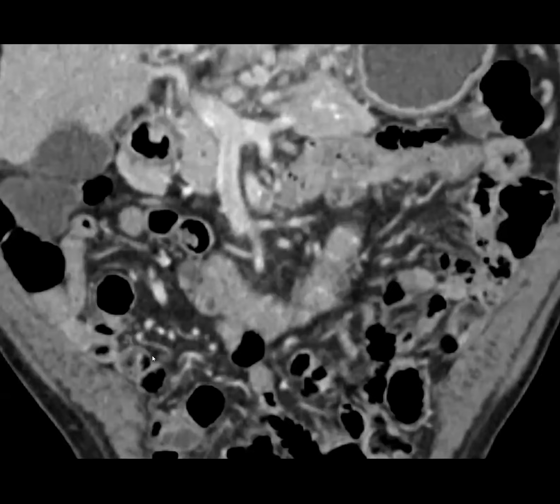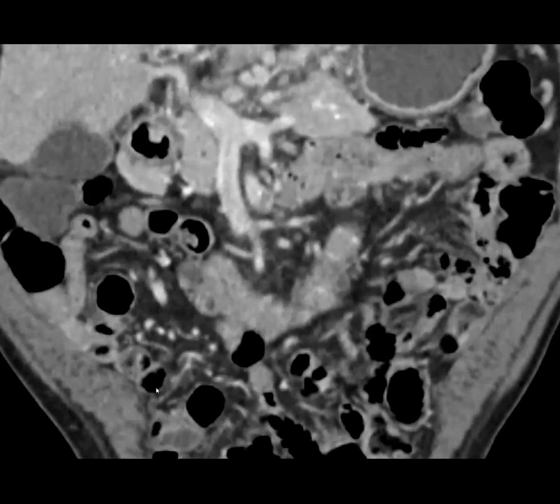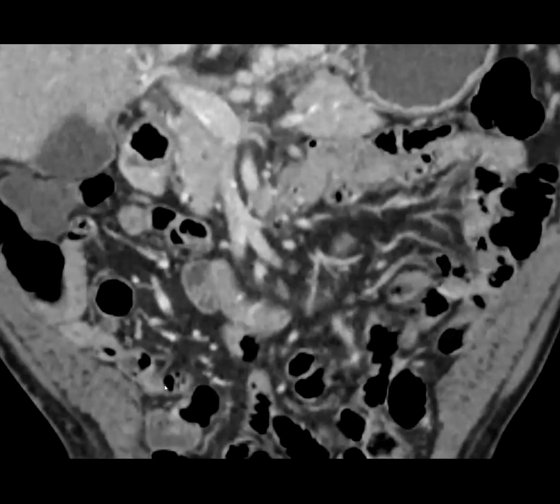But so I'm not sure if we have a non-con, but hyper attenuating mass in the proximal duo. We are relatively close to the head of the pancreas. But yep. Things that I would be worried about is any type of neuroendocrine stuff. You think about what clinical manifestations, any history of things that could lead me to insulinoma, gastrinoma, stuff like that. Awesome. Okay. So those are pancreatic neuroendocrine tumors. And then in the duo, you can also get gastrinomas because we're in the gastrinoma triangle.